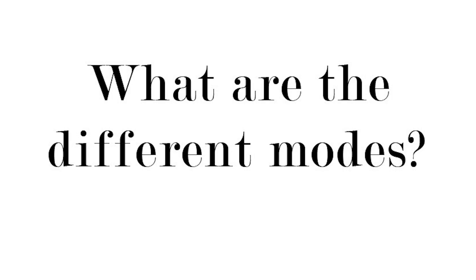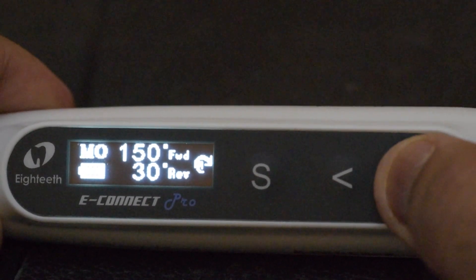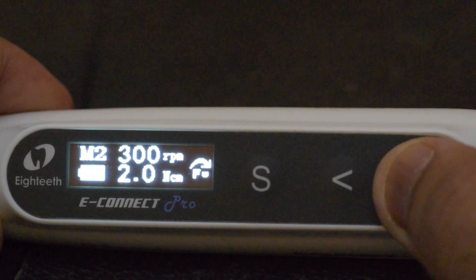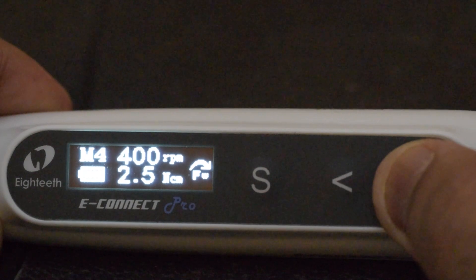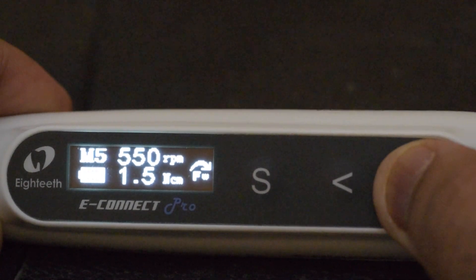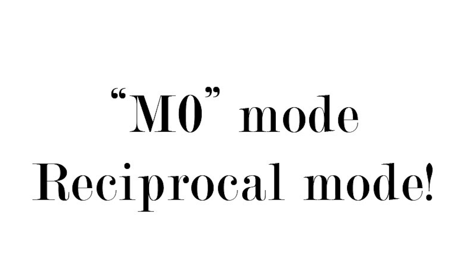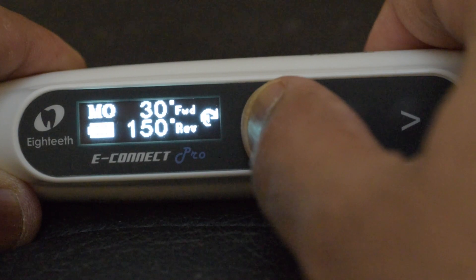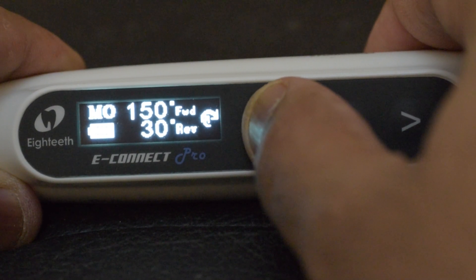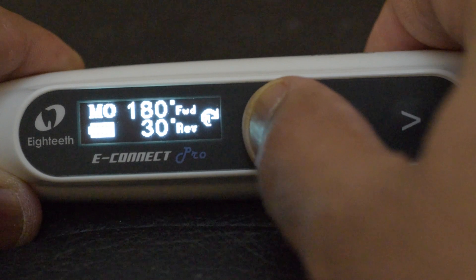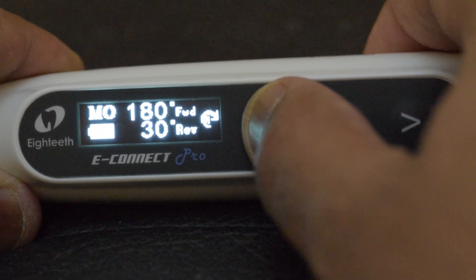Once you switch on the unit you will see that there are modes ranging from M0 to M6, and for each mode you can adjust the speed, torque, and the rotation. The first mode is M0, which is the mode where you can activate files that are run on a reciprocating mode, and as you can see there are multiple reciprocating modes in this program.